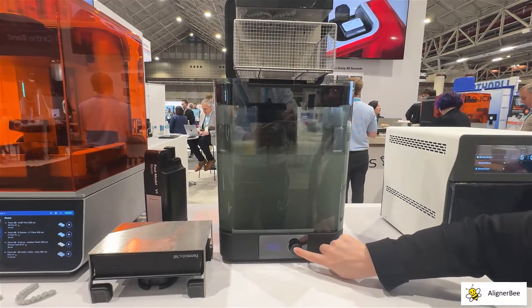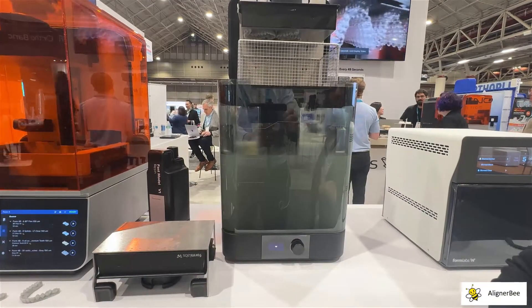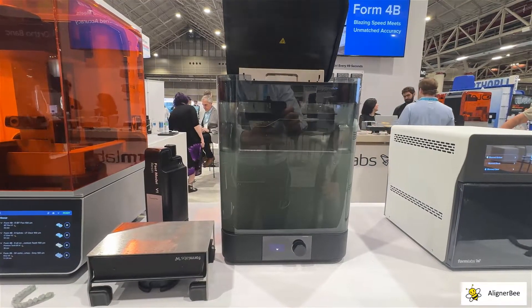With these incredibly fast print speeds, we're going to be able to utilize this new system both to help us with our same-day starts and with our same-day aligners.